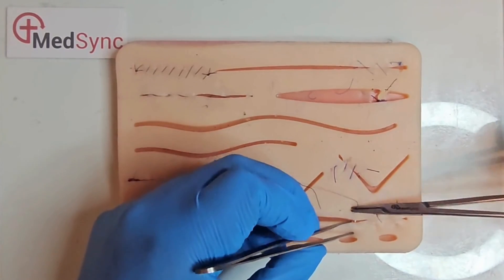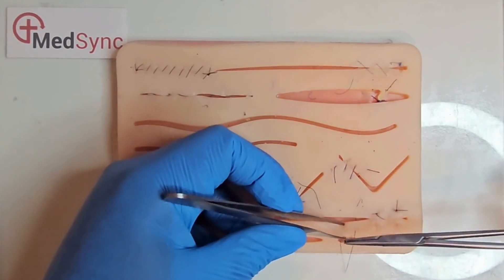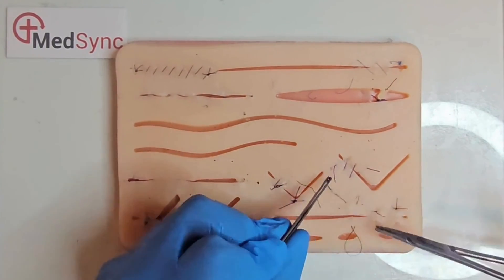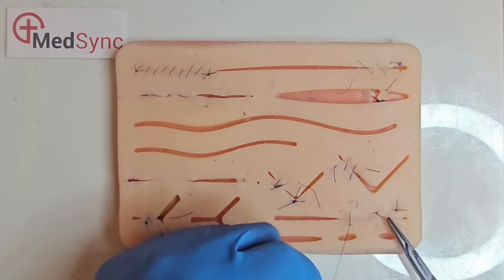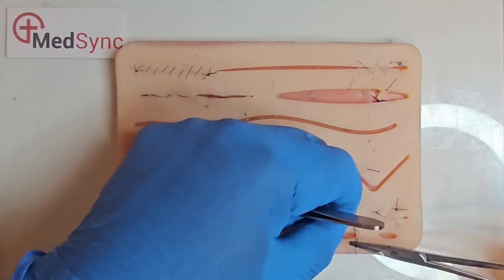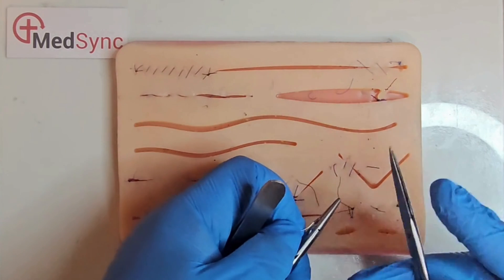The Summerlad locking mattress: this is formed like a horizontal mattress — the third bite adjacent to the second, the exit point adjacent to the first. Before pulling the loop flush, you pass the needle through the loop and then tie your knots. This is excellent for distributing tension across a gaping wound, reducing the risk of pressure necrosis.